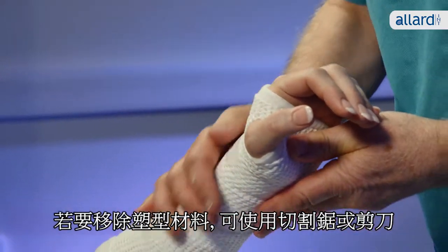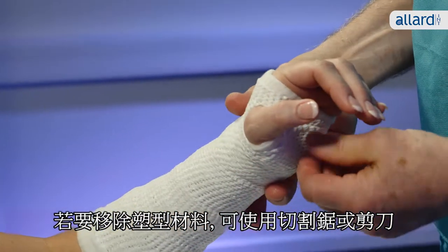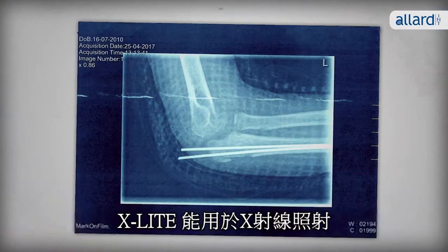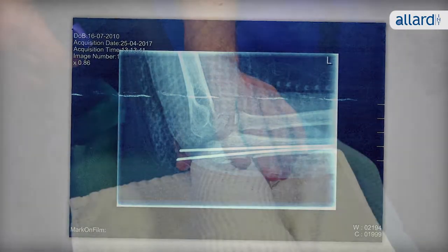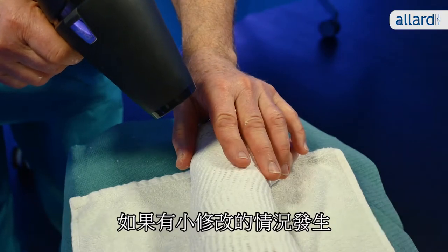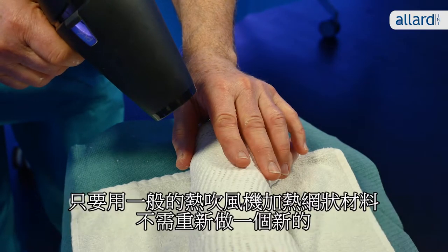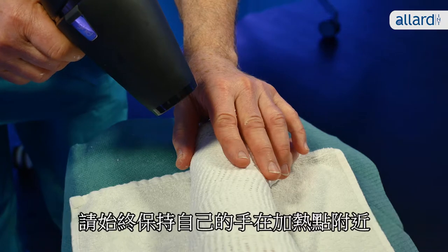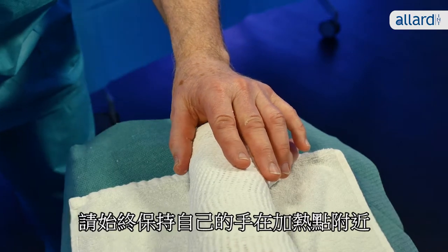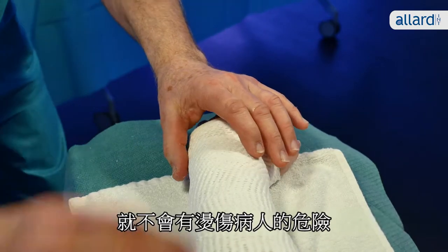To remove the cast, use a cast cutter saw or scissors. X-Lite is of course X-ray translucent. If a situation occurs which requires small changes to your splint, you can use a regular hairdryer to reheat the material instead of making a new cast. Always keep your own hand near the point you're heating so you don't risk burning the patient.